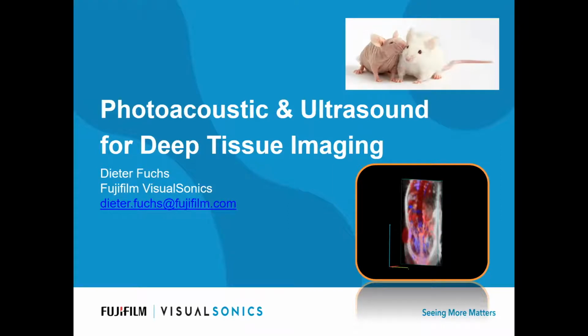The main reason is that photoacoustic gives excellent molecular and functional molecular information. Combining it with ultrasound for multimodality imaging gives also the anatomical location, the precise anatomical location in 3D, also 4D actually right now.